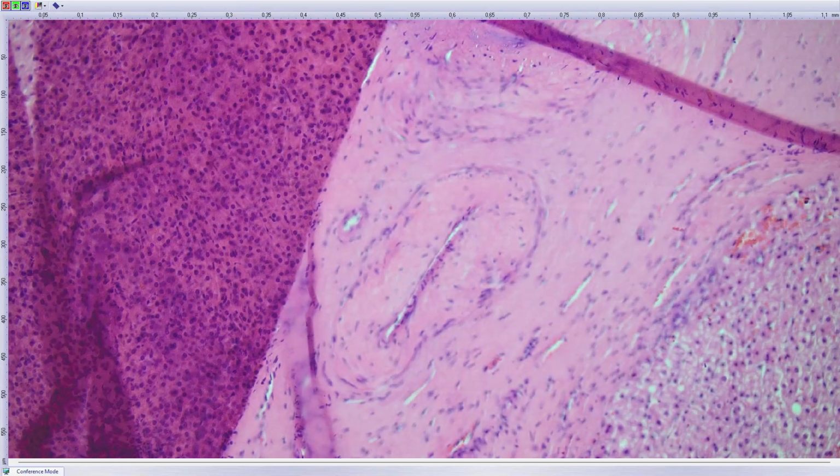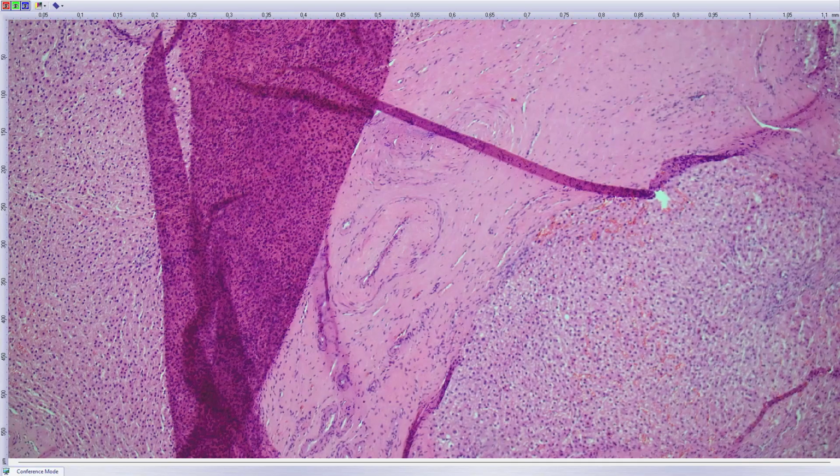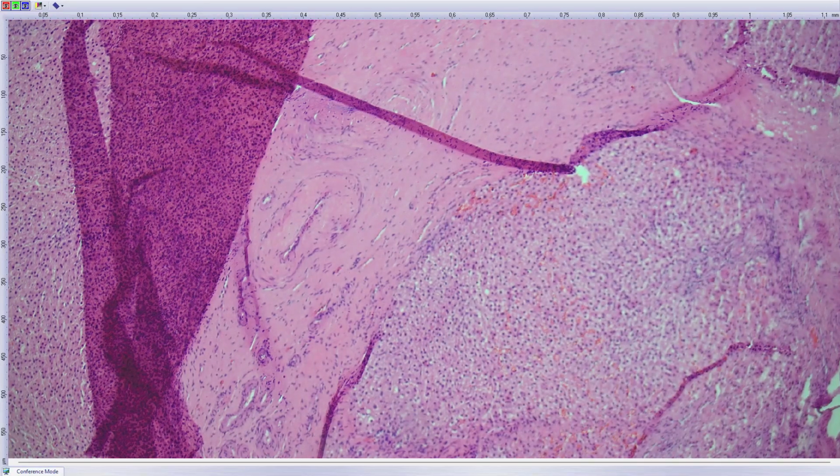Does anybody from the residents have idea what the diagnosis is? Once again? FNH? Yes, FNH. Focal nodular hyperplasia is the diagnosis. The helpful thing is that it looks like cirrhosis, only it is local, it is not diffuse, and you have to know from the clinician that this is a focal process, this is a lesion, and it is not considered neoplasia.